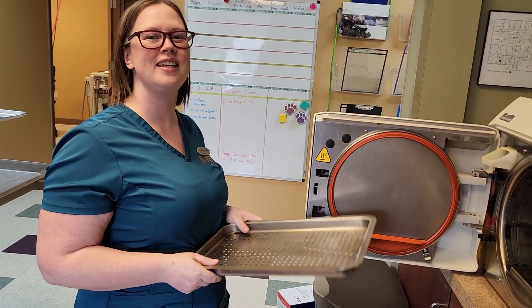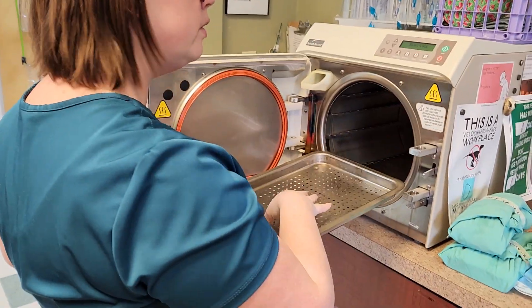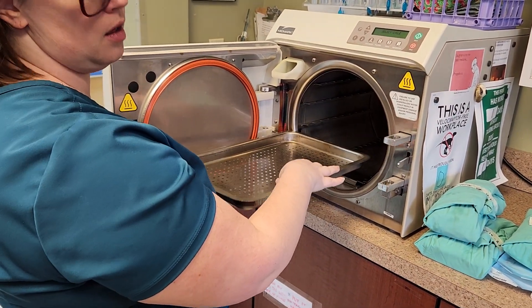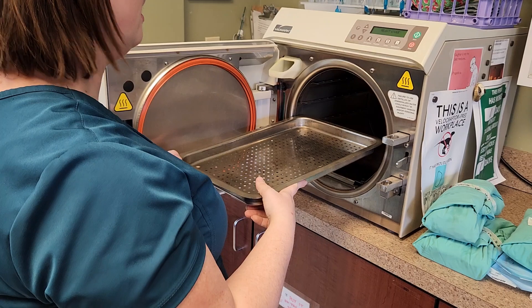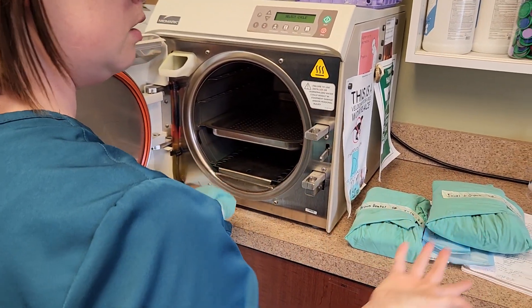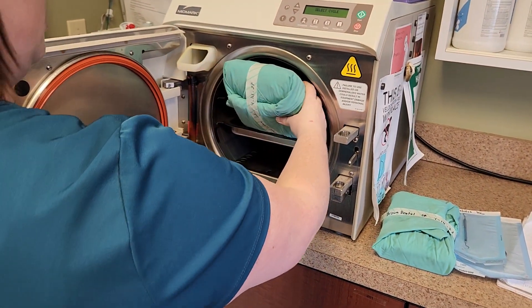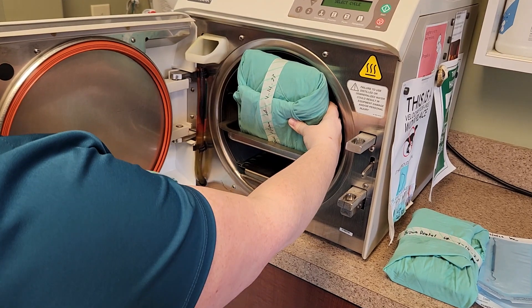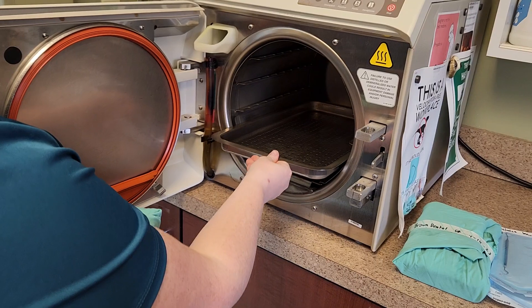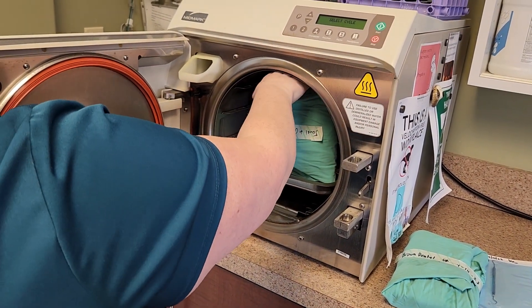We're going to load the autoclave with packs now. You can either load them on the tray and then put it in, or put the tray in and then load them — which is usually the way I do it. It's got three different sizes, so it shows you how it goes. As you can see, that's too tall at that setting.